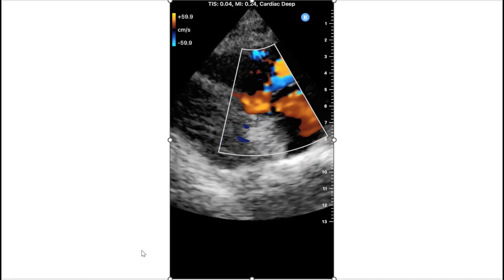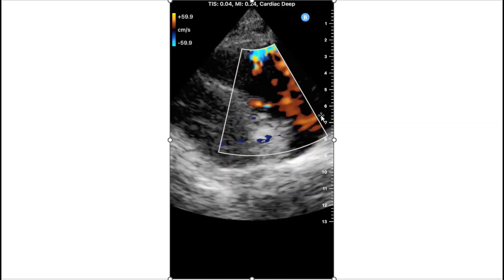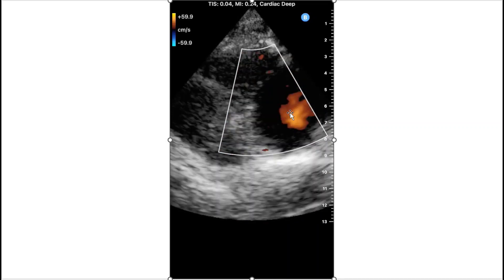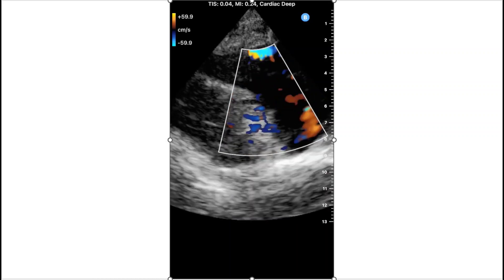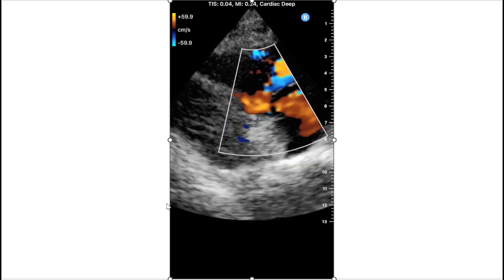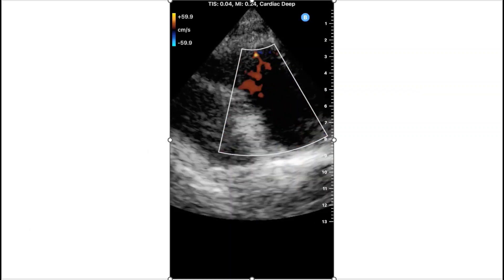This is that same RV inflow view with color Doppler, and we can assess for tricuspid regurgitation. Here you can see that there is no blue flowing backwards, and therefore there is no tricuspid regurgitation.